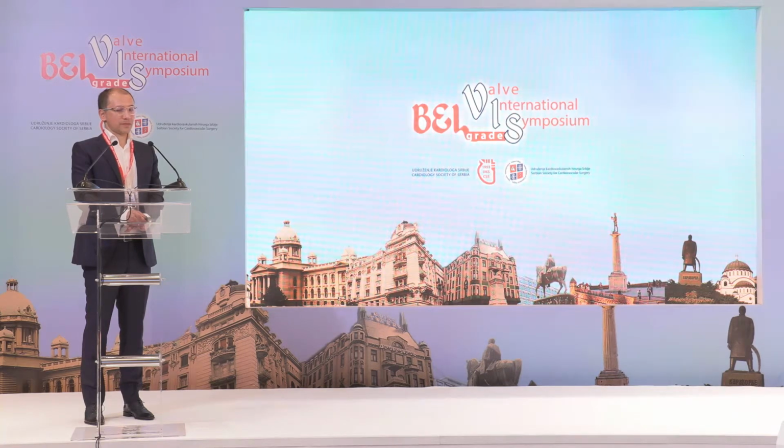I intentionally didn't mention His bundle pacing because there are not a lot of randomized controlled trials regarding conduction system pacing and His bundle pacing, which was the first technique applied. The other one is LBB pacing. There are not even randomized controlled trials regarding the success of His bundle pacing and late prognosis.